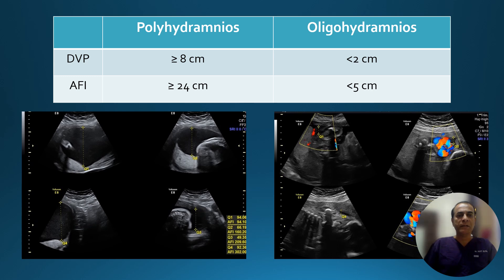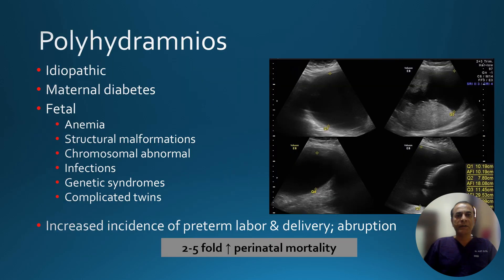These are some examples of how polyhydramnios or oligohydramnios can be seen on imaging. On the left, we can see the AFI is 30 centimeters — this is polyhydramnios. The picture on the right shows no liquor while the pockets contain only cord — this is a case of oligohydramnios.